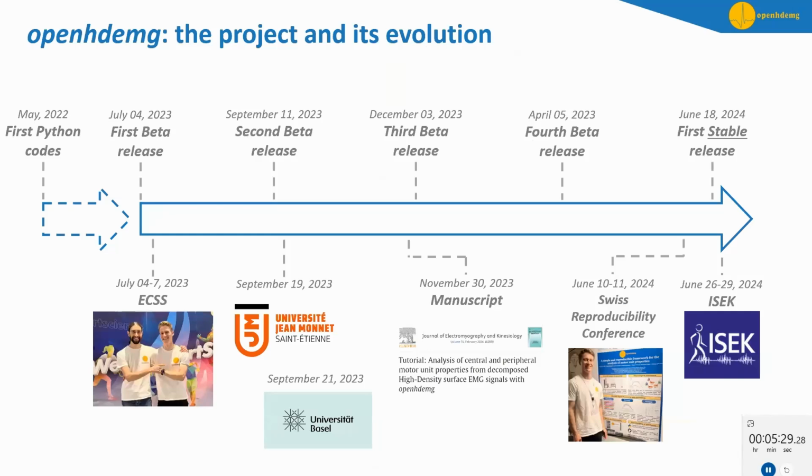So the openhdemg project began more than 1 year ago. 1 year ago, we released the first version of openhdemg. It was a beta release.